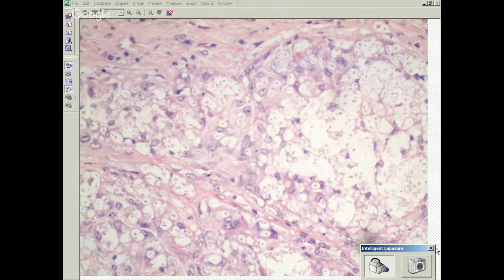Okay, so what stain should we do? This is considered a granulomatous inflammation, right? So we have to do all of our stains for granulomas. But, so what stain? Silver. Oh, silver. Yeah, silver stain. We use GMS as our silver stain. And then you should also do stains to rule out, you know, we should do AFB, right? In addition to GMS, okay.